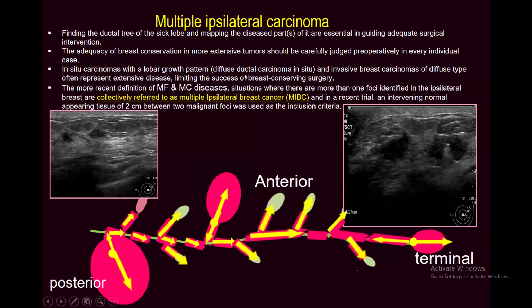Here we can see the largest terminal duct lobular unit, and all these segments involved. It might first arise here and then cancerize the duct and other lobule.